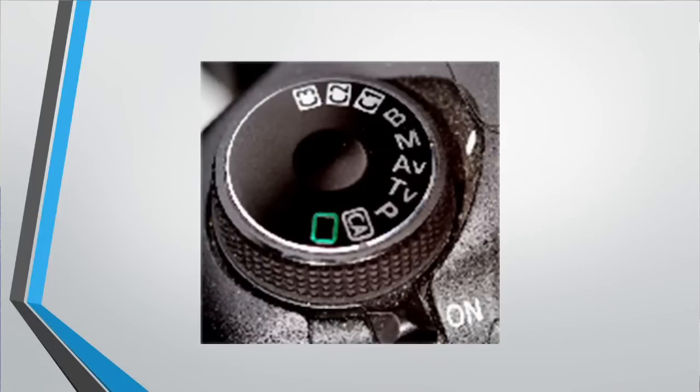It depends on what your goals are, and what Karsten was saying very simply is, it's called the mode dial on the camera. He puts it on manual, which basically means you're in total control of the aperture and the speed, and the distance at which you're going to take your picture. So if you're doing a series, every single time you take a particular picture, it's the same distance all the time.